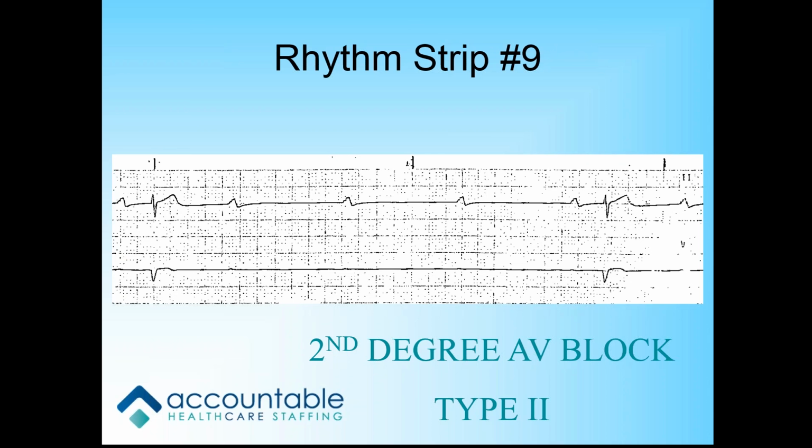Okay. So it's some QRSs don't get through then? Correct. The P wave's not causing a QRS. It's blocked, because it's an electrical signal. So that's what blocked means. Your P wave is doing its job, but that signal is getting blocked someplace on the way to the QRS. Okay, I think I was just taking the poem too literally, so that makes more sense. Thank you. You're welcome.